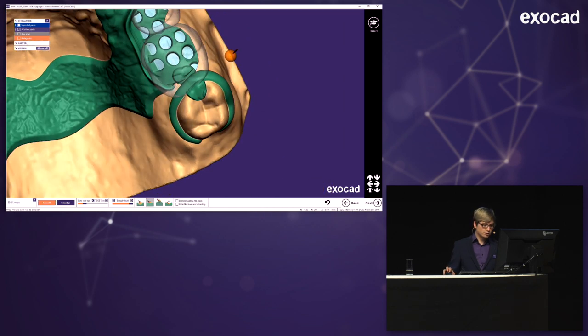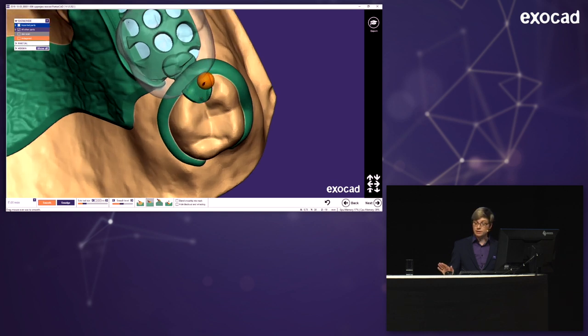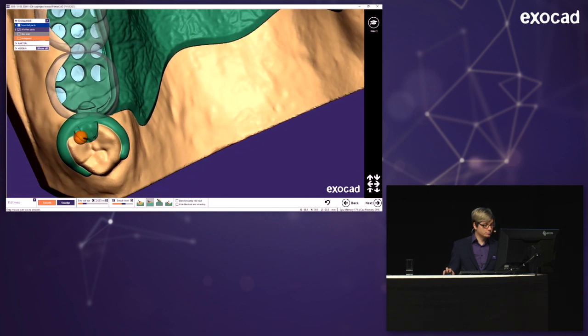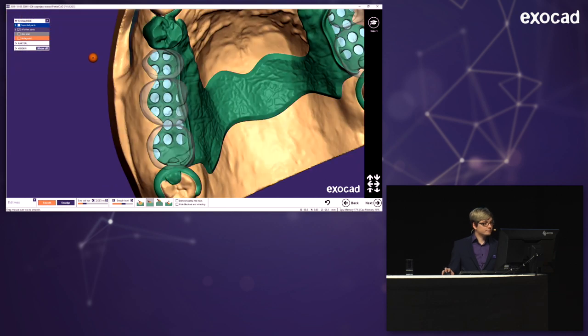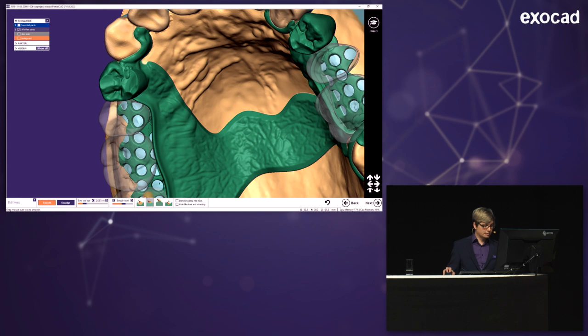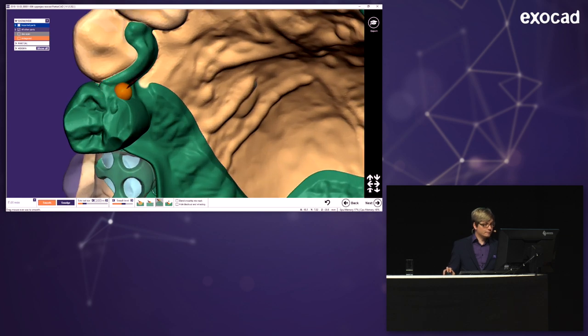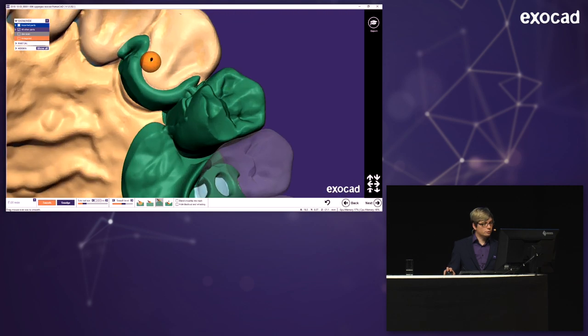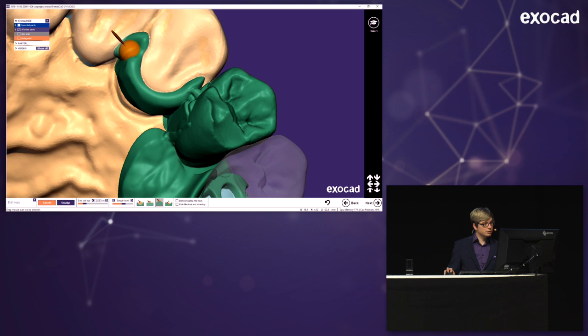Then I think I'm trying to smooth the occlusal rest, and it's the same as in the dental CAD. I hit Control and scroll my mouse wheel, and you see the smooth level down here just changing. It's the same kind of logic in both of them. So I'm having a little lower smooth level, so I'm not really hurting them, just switching up everything I designed not that nice. And now I can start by adding. But this one's actually already pretty nicely done. And here I add as well.